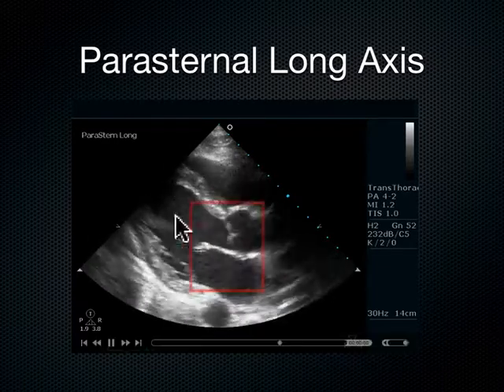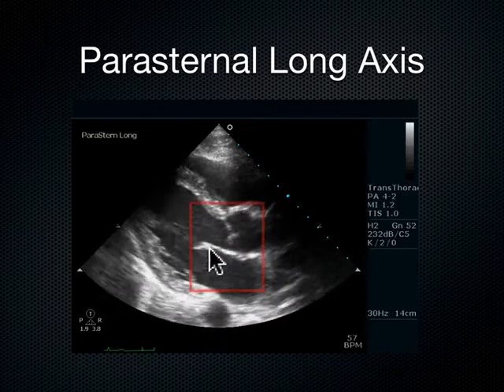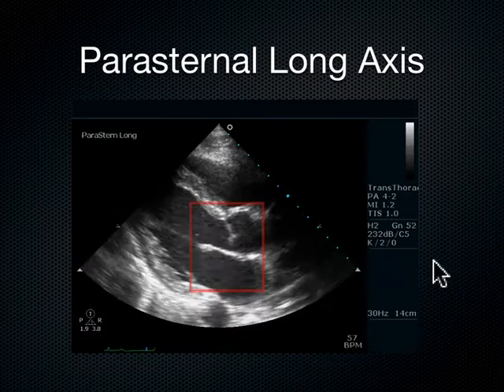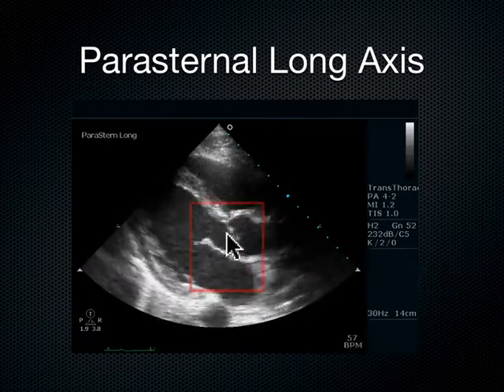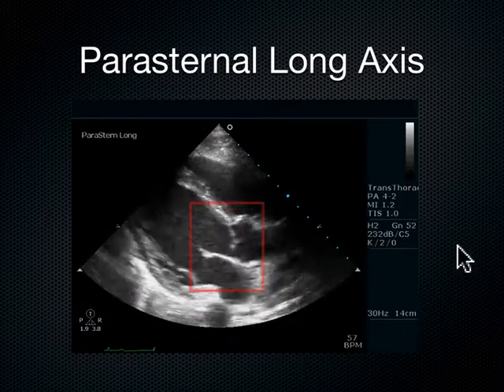Now I'm going to focus on this area right here first, and I'm going to see how well that septum comes up and that septal leaflet comes up and smacks that septum. If it does, great, which it's doing, good. And the sequentiality between the mitral valve and the aortic valve. Do they fire at the same time, or is it sequential?